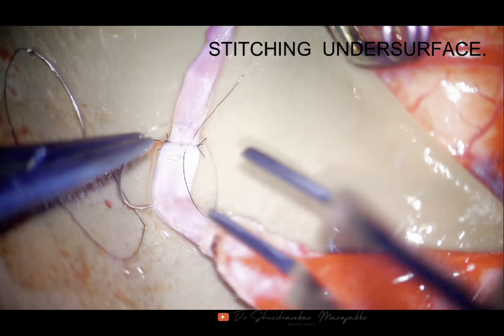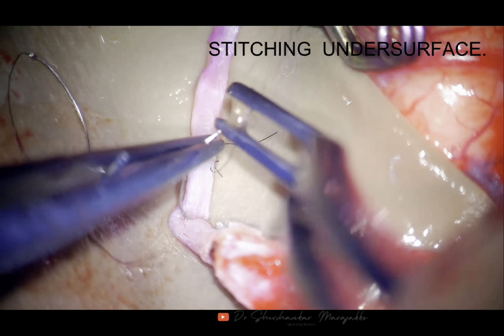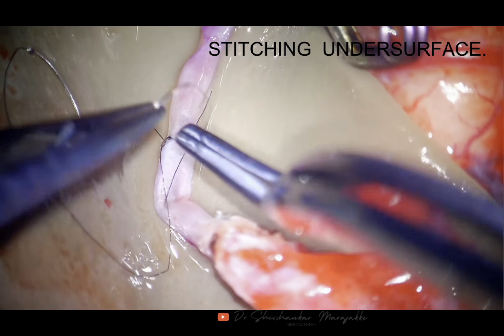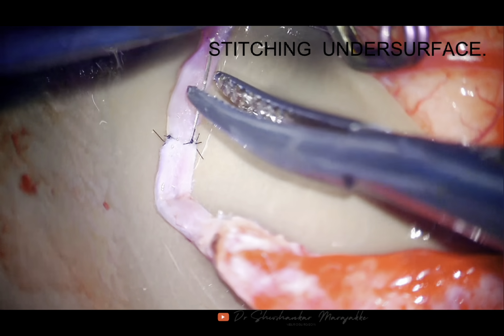We have to zoom in, zoom out with each step, and we cannot pull these suture materials or handle them roughly because they might cut through from the needle itself.